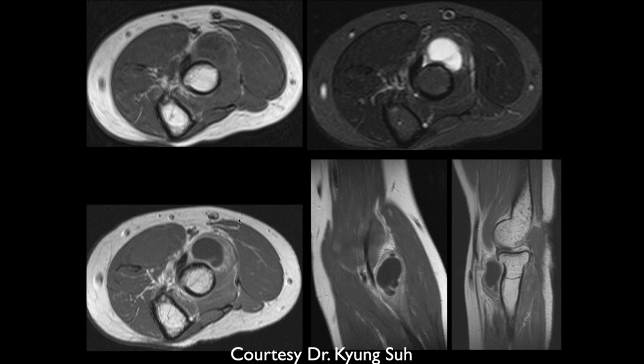So, and then here's another example. This is from South Korea where we can see fluid in this same bursa. I think there are 3 bursas in this area. I don't think it's all that important to differentiate.